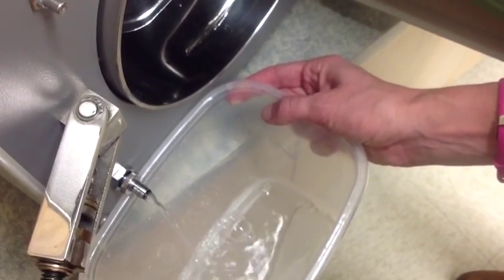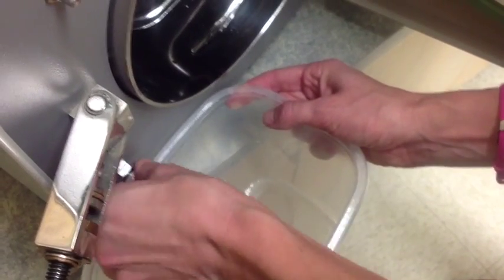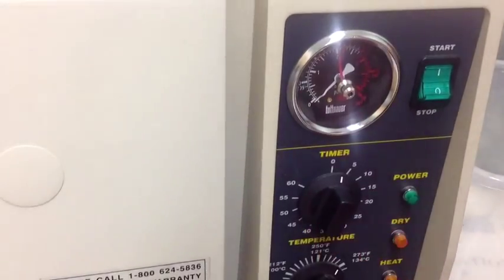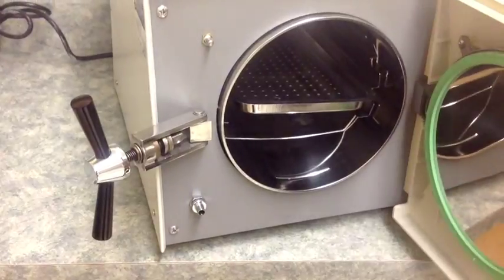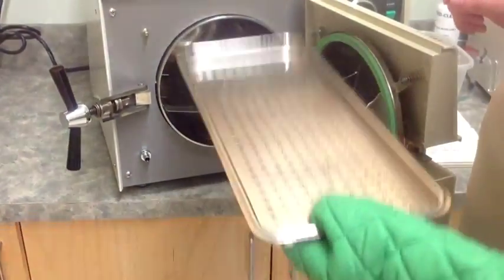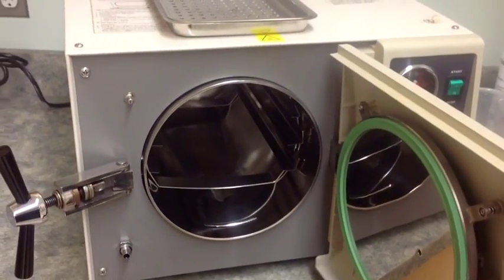Run it for 6 minutes at 270 degrees Fahrenheit. After that cycle is complete, drain the autoclave again and refill it with another 2 liters of distilled water. This time, run a 3-minute cycle again at 270 degrees Fahrenheit. When finished, drain the reservoir again and allow the sterilizer to cool to room temperature.